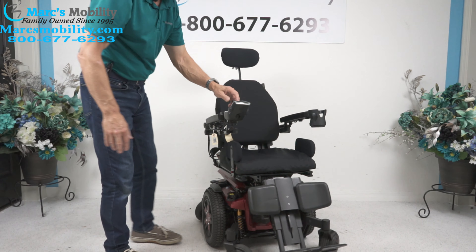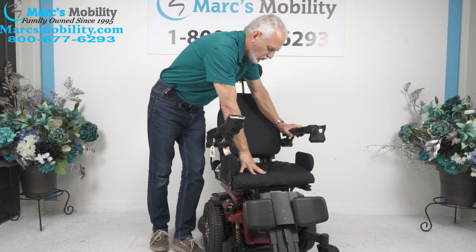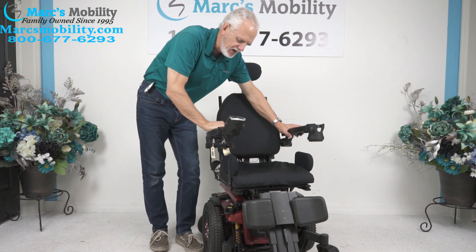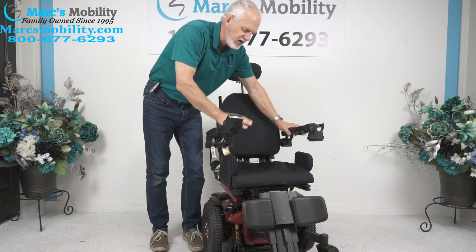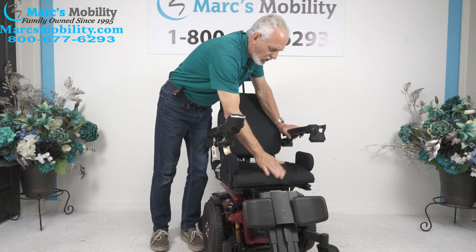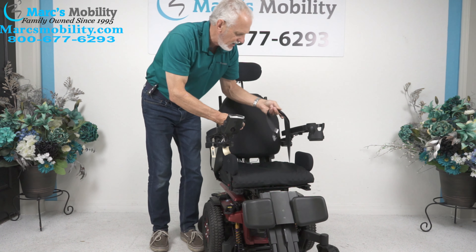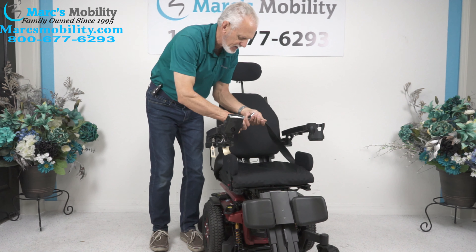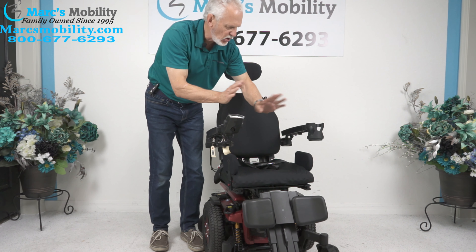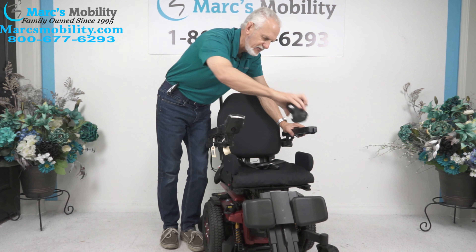The seat of this power chair is 16 by 18 — 16 wide, 18 deep. It's a real nice foam gel cushion. If this seat is too small or too big, we can adjust or expand these seats — just let us know. The joystick is on the right but can be put on the left with no problem if you're left-handed. We'll just move the cup holder to the other side if needed.